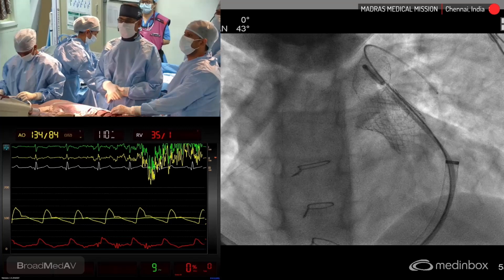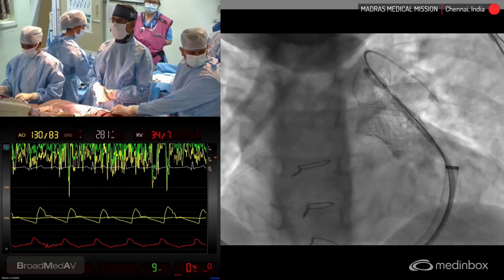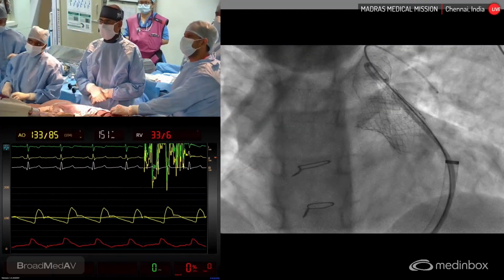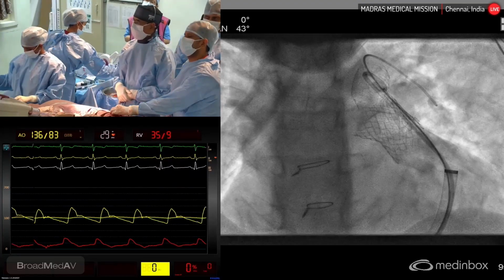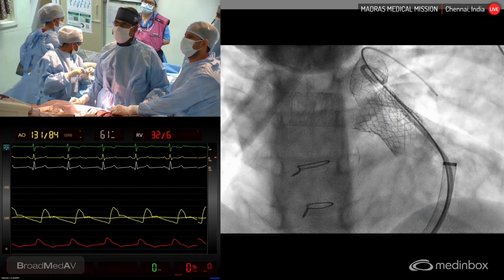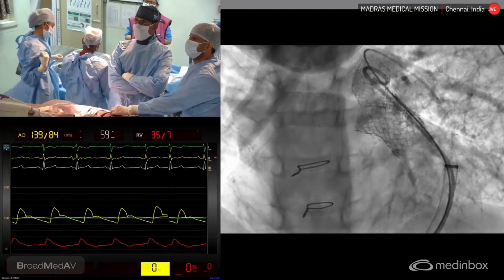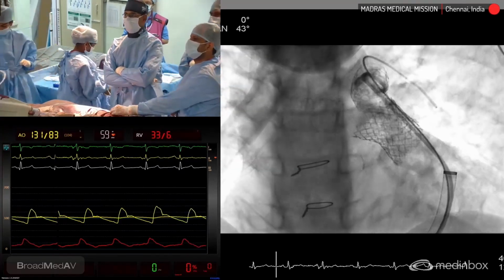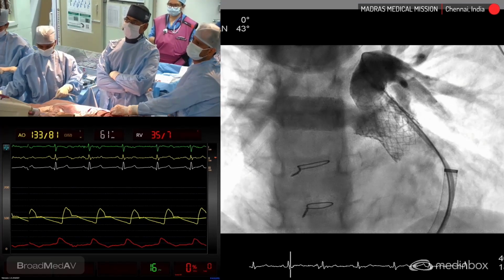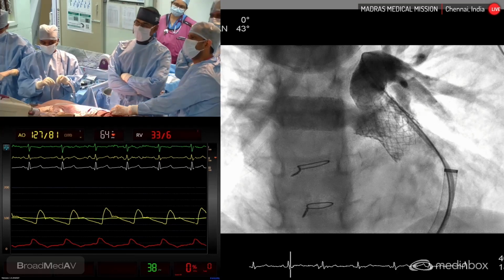Now we are going to give 25 ml, 30 ml at 15 rate. The chin of the patient can slightly move, or we can collimate a little bit. Correct. That's good. Ready? So we are making first angiogram in this view. Let's freeze this picture and observe. Yeah. Next picture. Yeah, correct. No, previous. Yeah, it's looking quite good.